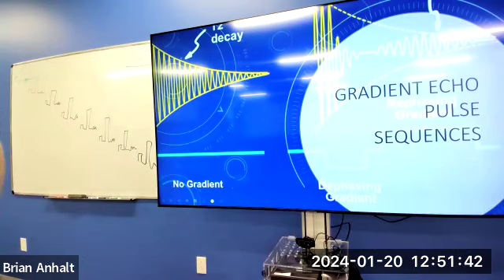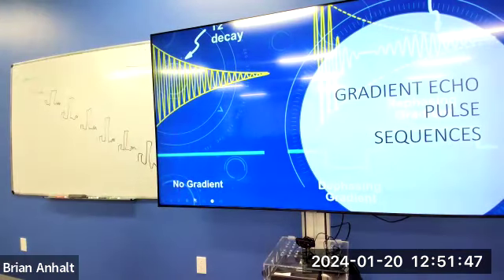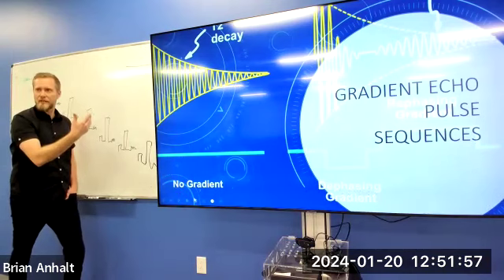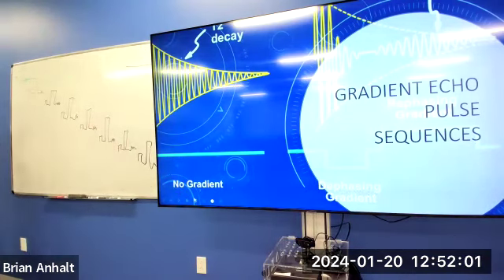So that's multi-slice acquisition. Like I said, I just want you to start picturing it. I'm not gonna ask you any questions about that on this quiz. But it kind of makes sense, right? If I have to collect one echo per slice per TR, I'm gonna run out of room with shorter TRs. If I have longer TRs, I'm gonna be able to prescribe more slices and collect data from more slices per TR.